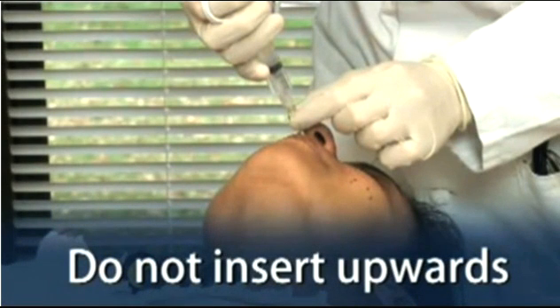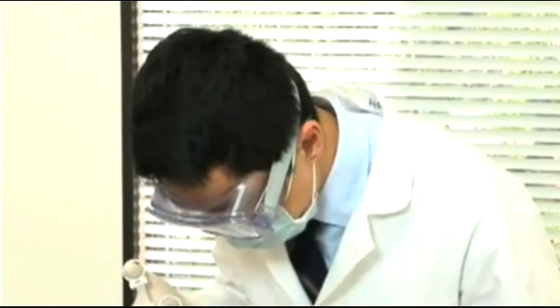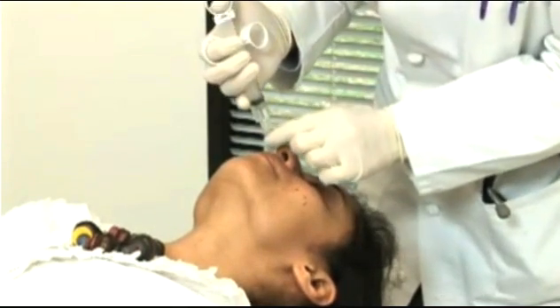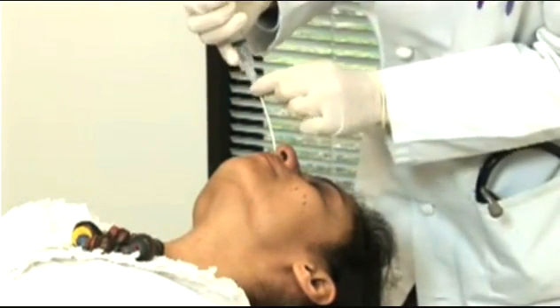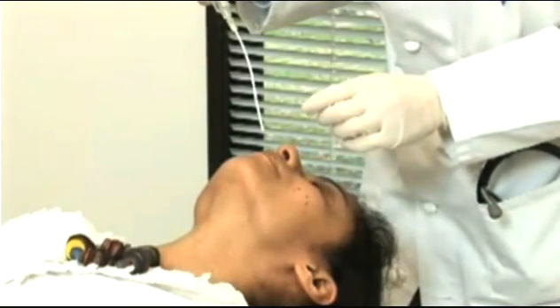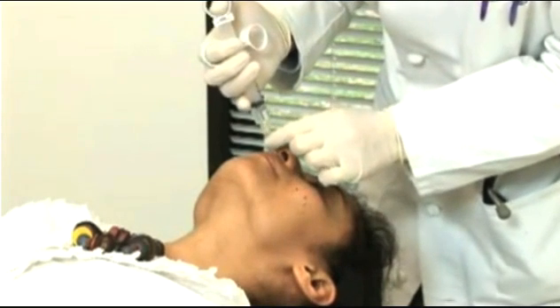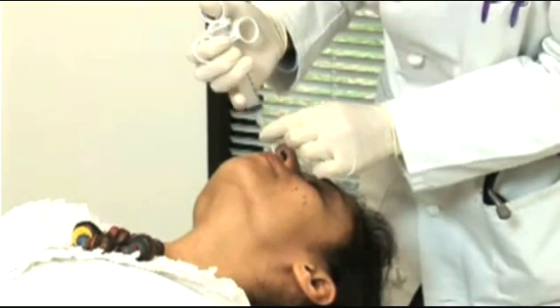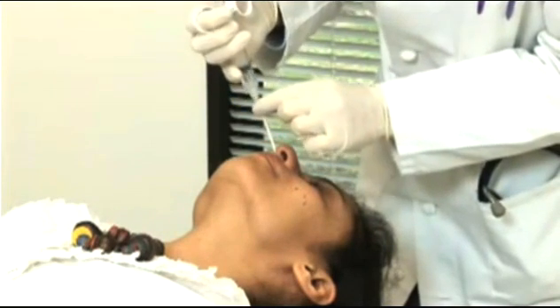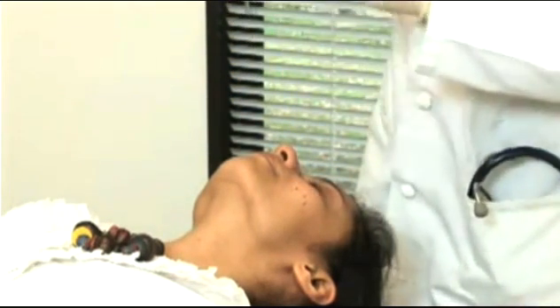If an obstruction is encountered, try the other nostril. Using a smooth motion and without moving the tube quickly, push and then pull the syringe plunger to expel and aspirate the saline. This must be done quickly to prevent the fluid from draining down the patient's throat. If you feel resistance while aspirating, the tube might be suctioned against the wall of the nasopharynx. If this occurs, retract the tube very slightly and then continue withdrawing the saline solution by pulling back on the plunger. Carefully remove the tube from the nose.